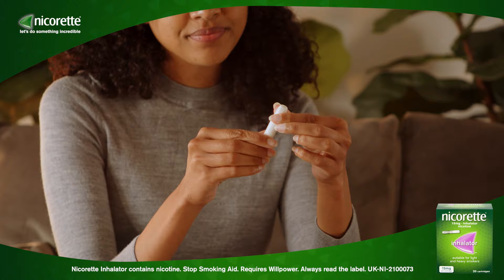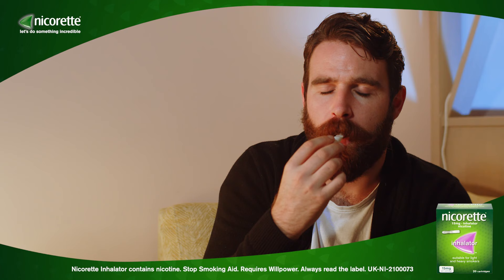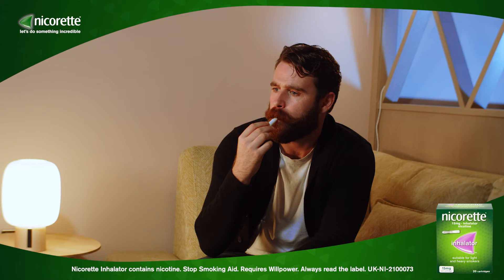Then place the inhalator in your mouth. Inhale using the inhalator with either deep or shallow puffs — choose the way that suits you. Either way, your body will receive the amount of nicotine required to give craving relief.